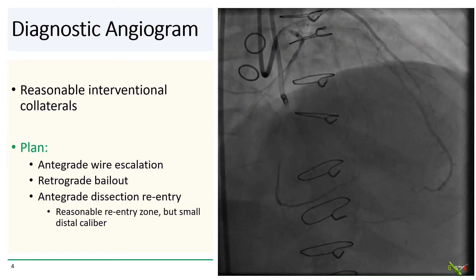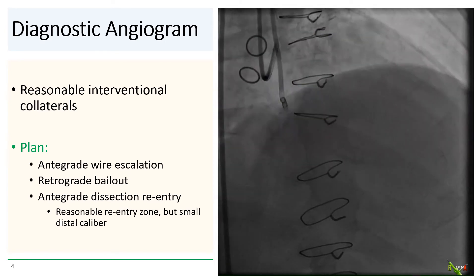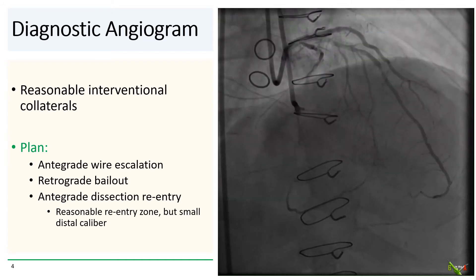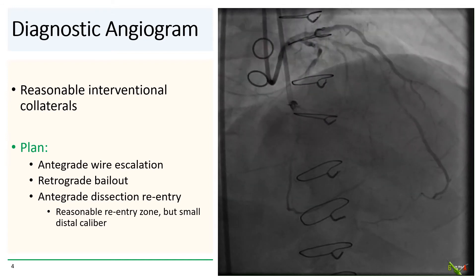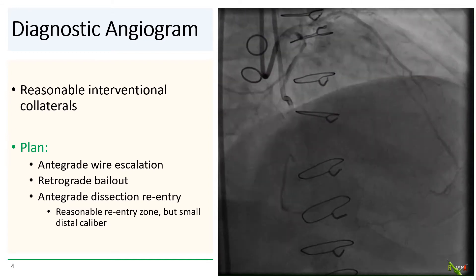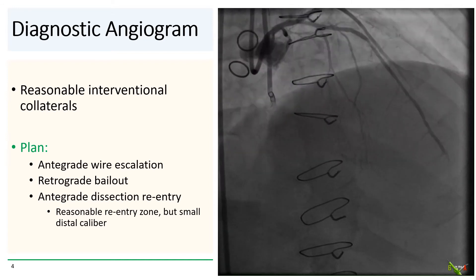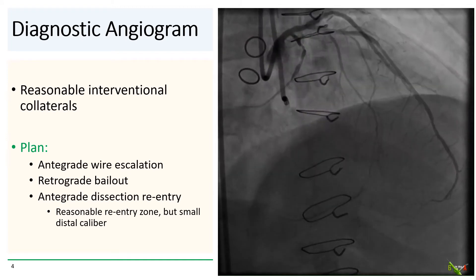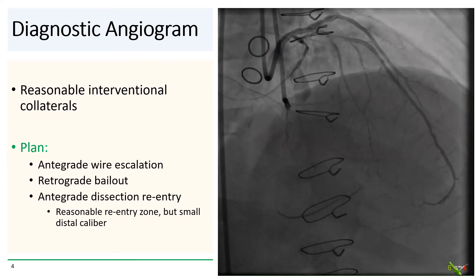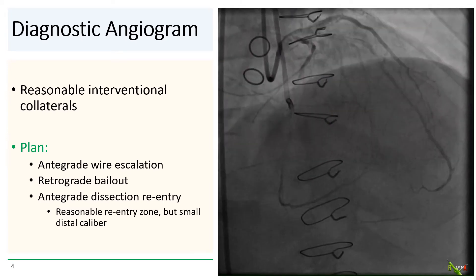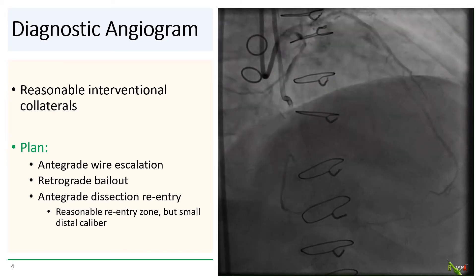For this case, antegrade dissection re-entry was thought to be less ideal. The potential re-entry zone was reasonably long, but the small caliber of the distal vessel made the target small.